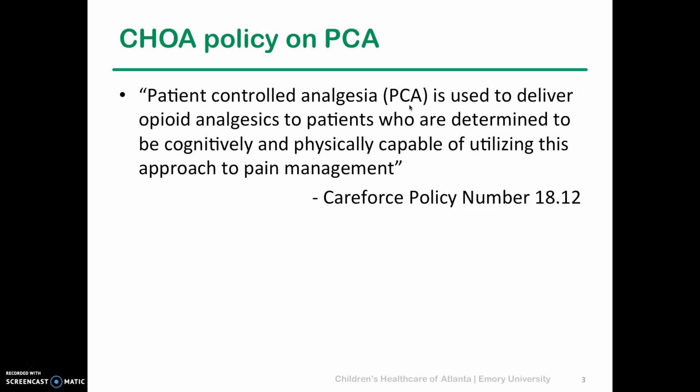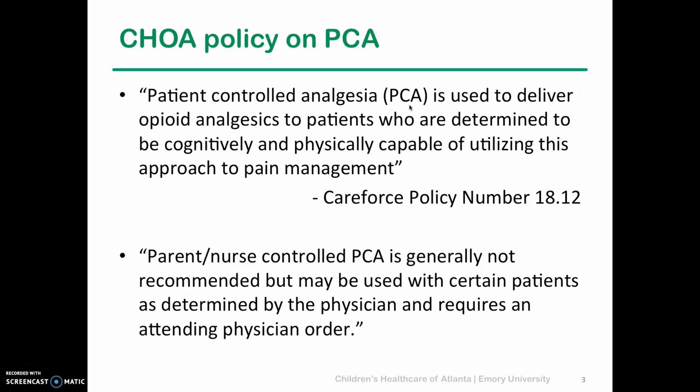However, oftentimes the question comes up, are parents or nurses able to push the button for a patient who is in severe pain? The policy specifically states that parent-nurse controlled PCA is generally not recommended, but may be used with certain patients as determined by the physician and requires an attending physician order.